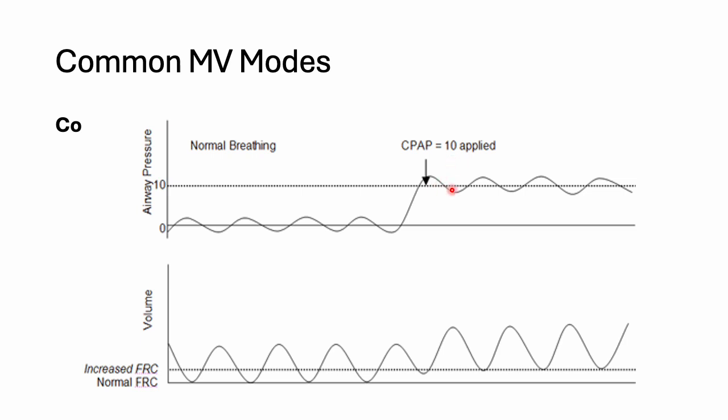In other words, you take a deep breath in, you let out about half the breath, and then you breathe at whatever is left in your lungs. Because whatever is left in your lungs exerts the pressure, and that's a new baseline pressure. So when 10 is added, your baseline pressure goes from 0 to 10. You continue still to breathe normally.